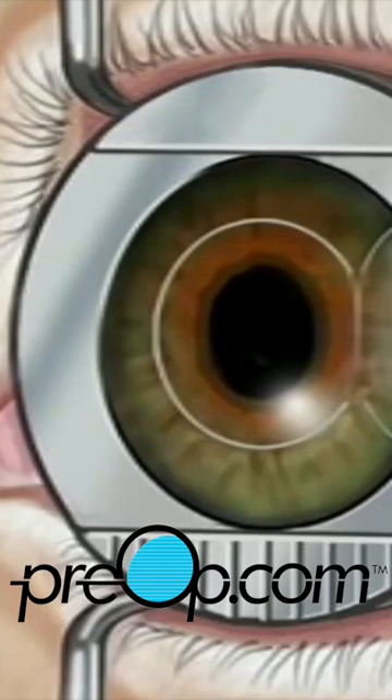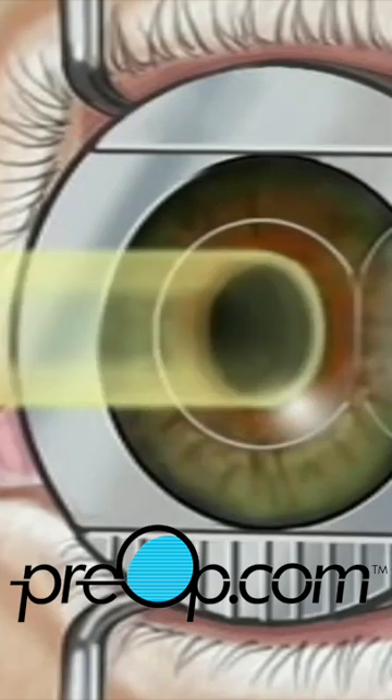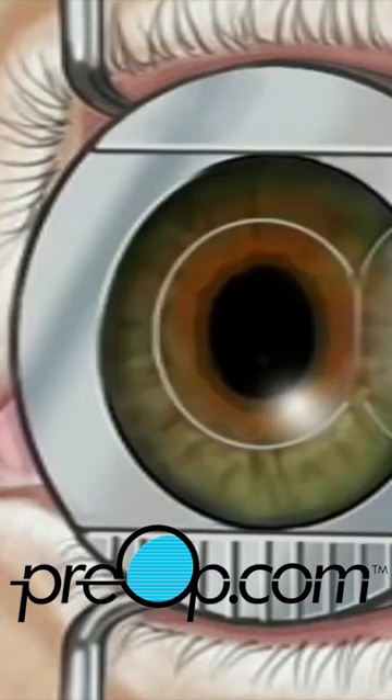Next your doctor will use a computer to control pulses of cool laser light. These pulses will delicately remove microscopically thin layers of cells from the stroma.